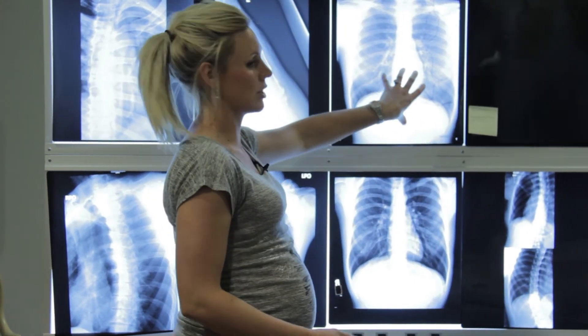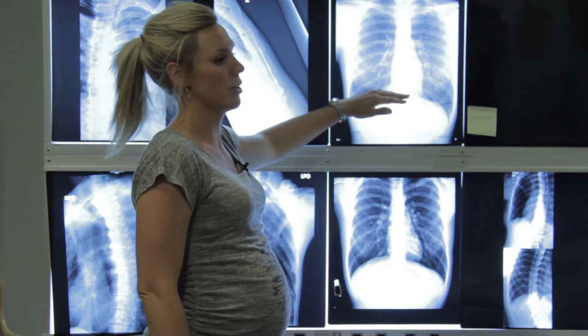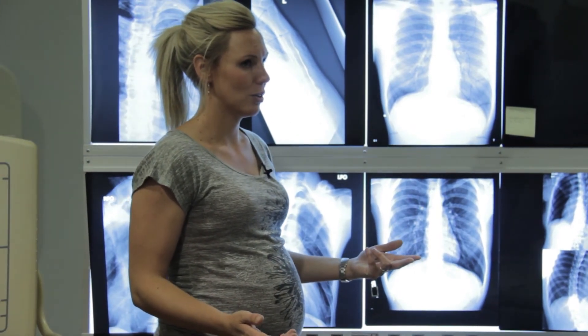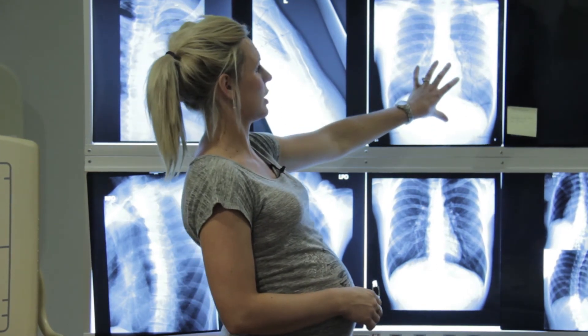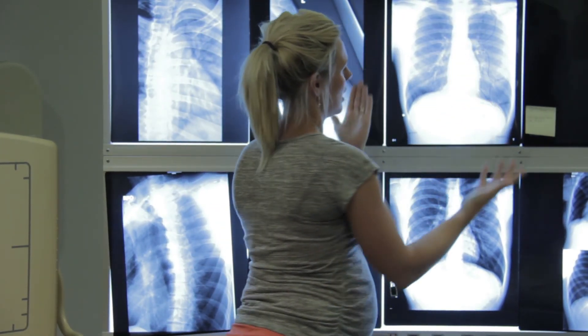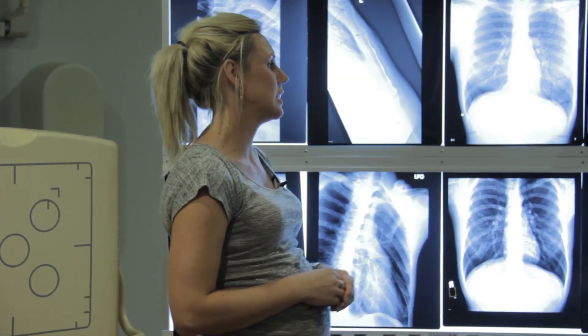So that's your first picture: an AP or PA of the affected side, collimated in. On your upper series, you want to center at about the level of T7, just like a chest x-ray, and you absolutely have to see at least ribs one through ten — similar to a chest x-ray. This is why we do these at 72 inches. Your technique is different, but you'll still be centered at T7 at 72 inches, then collimate in to the site of interest. Really, the only thing changing from the chest x-ray is your technique and collimation. You have to get at least ribs one through ten — that's critical.